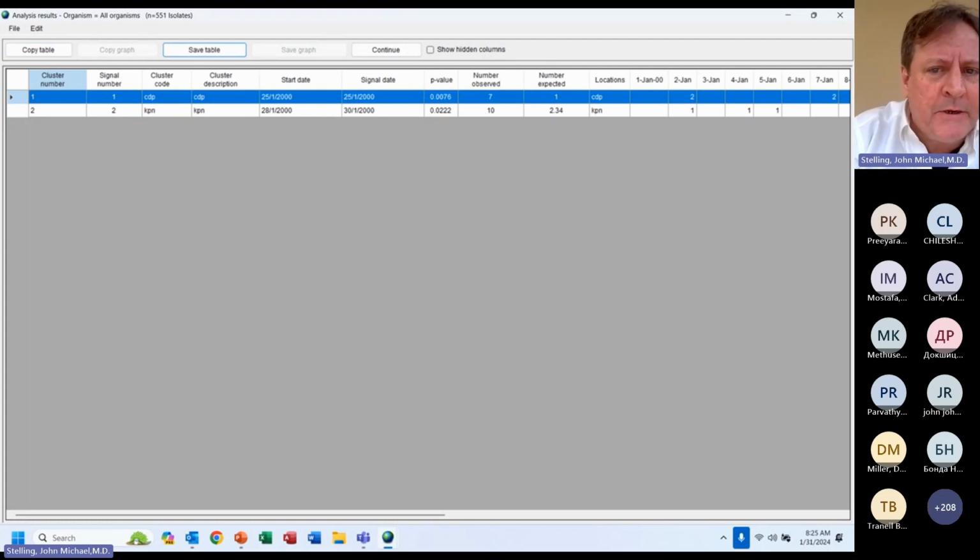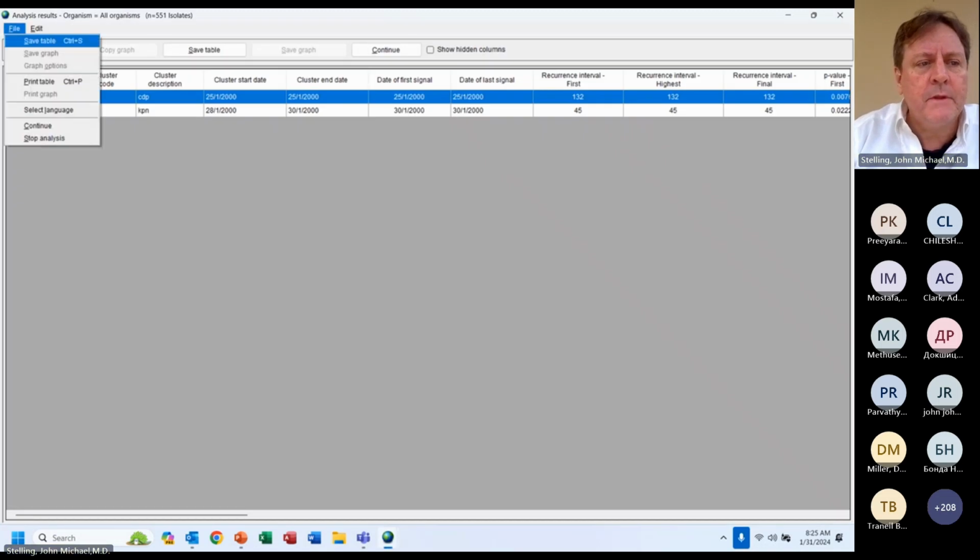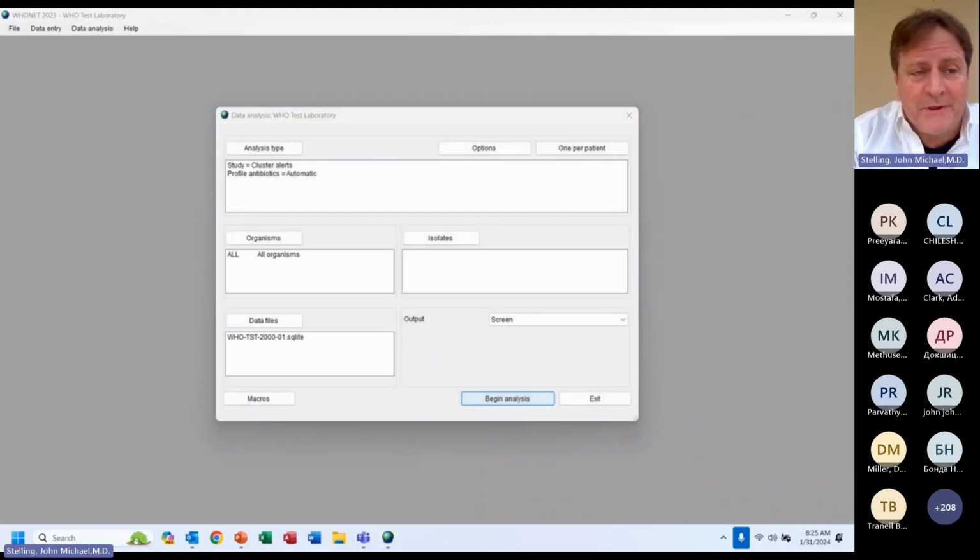Adam, there seems to be a small bug, I think. We're supposed to see the graphs here. So I'm guessing once we go from two variables back to one variable, we're turning off the graphs. Let me just verify if that's correct. I'd like to show you the graphs.